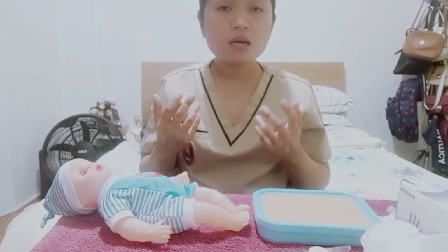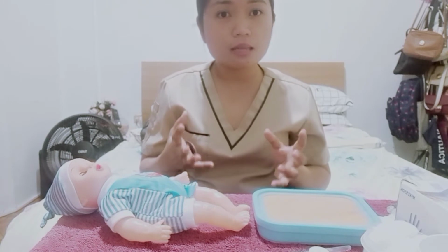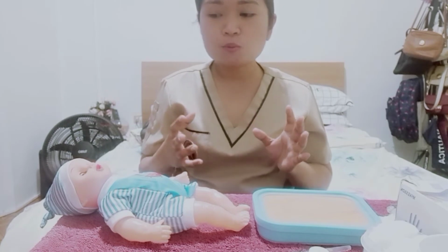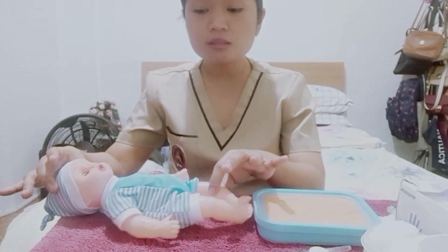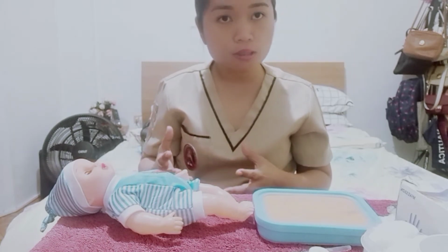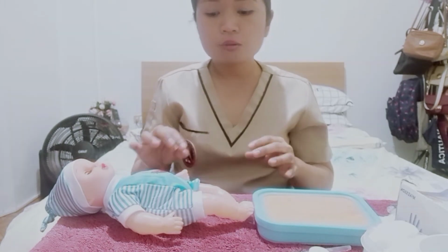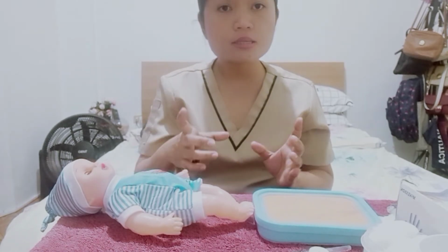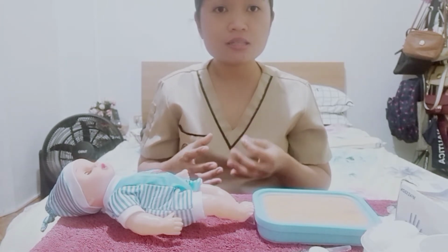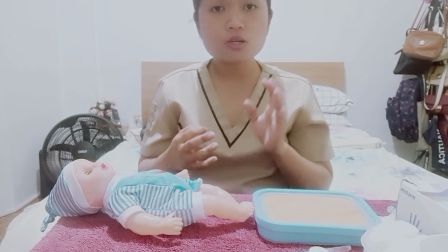So after that, for IM injection, we'll be using a 23 gauge, 25 mm in length syringe. Okay, so we position the limb of the patient, especially the site we are going to inject, to make sure that the muscle is relaxed prior to injecting. And then after we position the patient, we pierce the skin at a 90-degree angle, so as to safely inject the vaccine to the area.